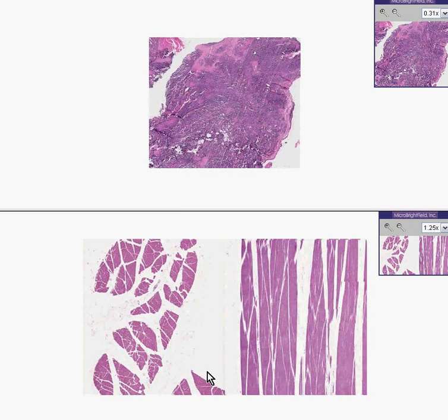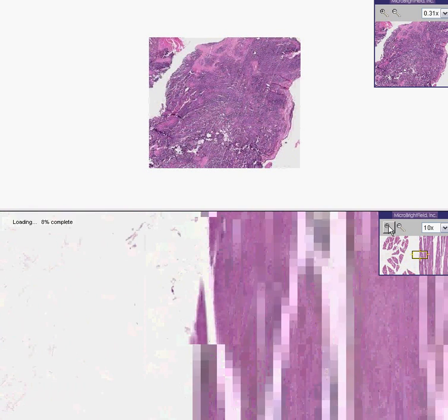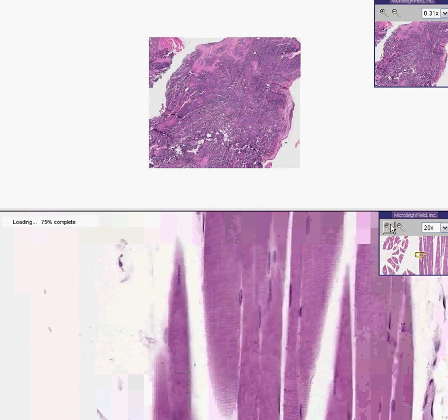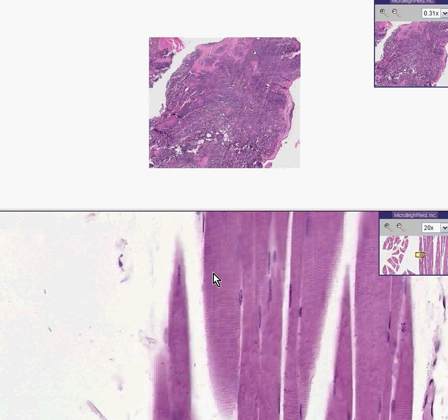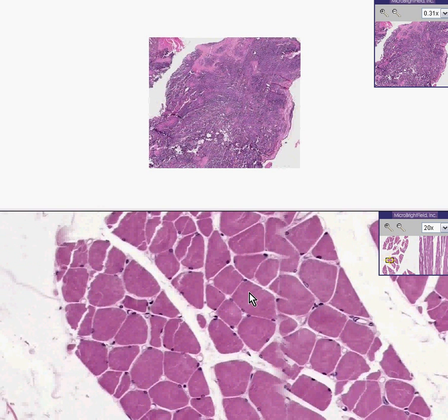Let's take a minute to look at classical normal striated or skeletal voluntary muscle. Notice that if you cut the fibers almost perfectly longitudinally, you will get a very beautiful idea of how nicely striated they are. You can also see the nuclei are at the periphery. If you cut the fibers in complete cross-section, you can see even more reliably how the nuclei are all at the periphery, but unfortunately you don't see the striations.